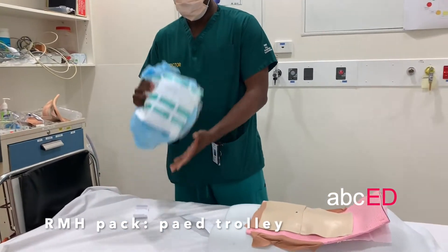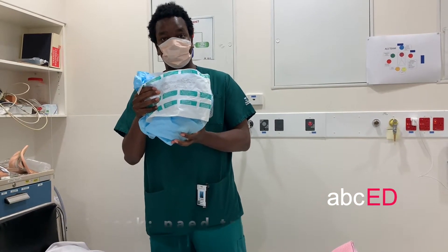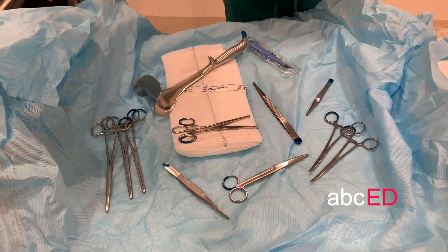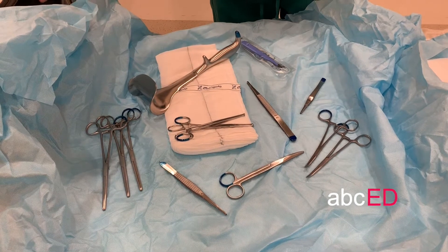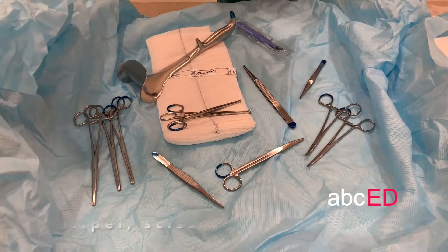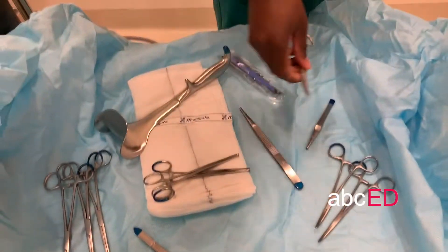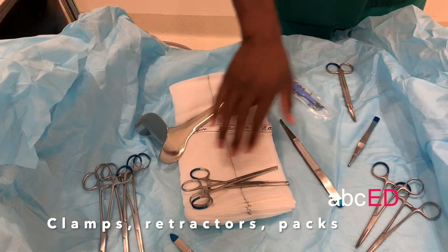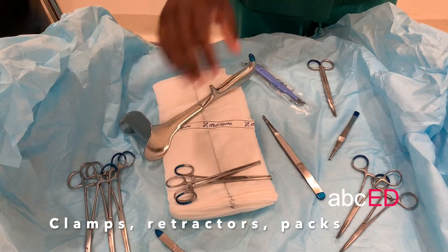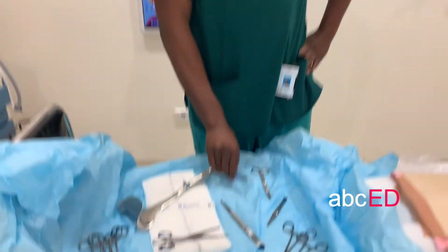We'll start by grabbing our hysterotomy pack, which lives in the bottom drawer of the paediatric trolley. Inside your pack you've got everything plus more that you will need to perform the procedure. All you need is a scalpel, a pair of scissors, clamps, a retractor, packs and various forceps — but to keep it simple, as an ED clinician you can perform this with just a scalpel.